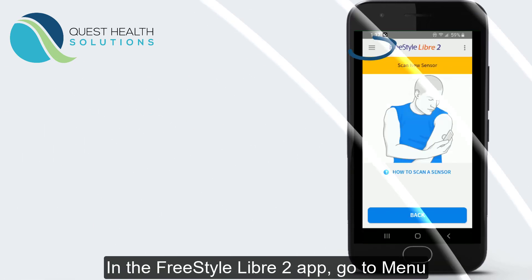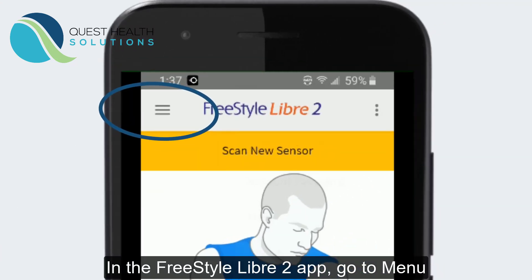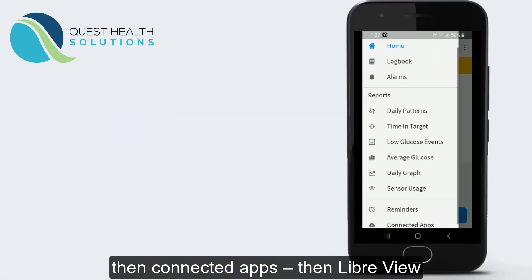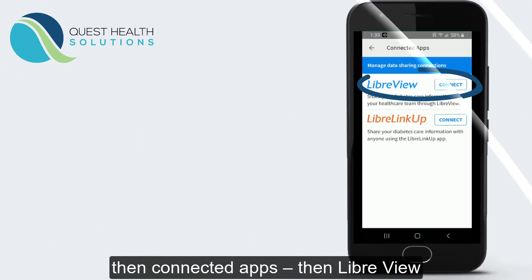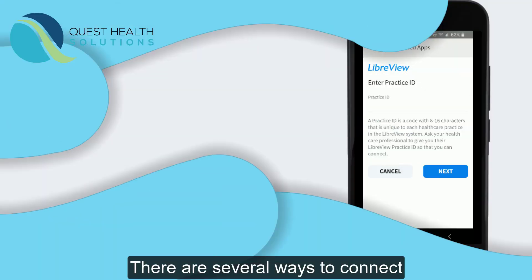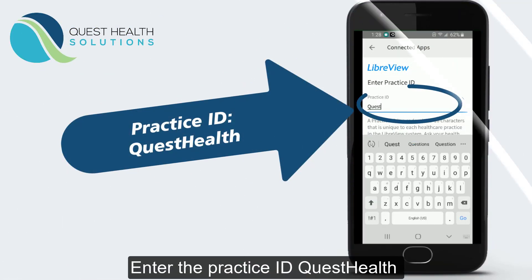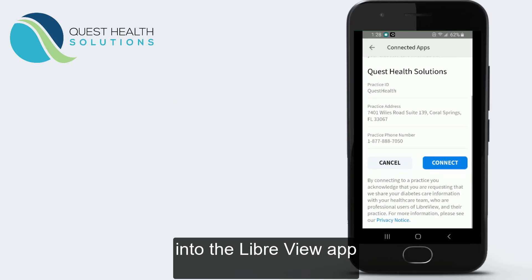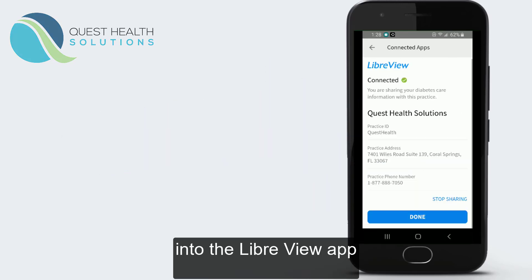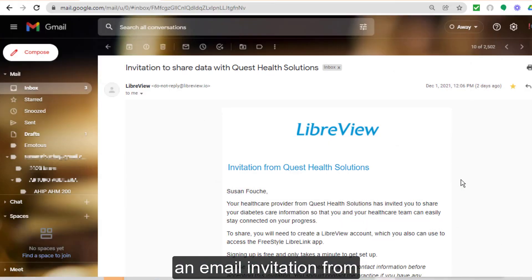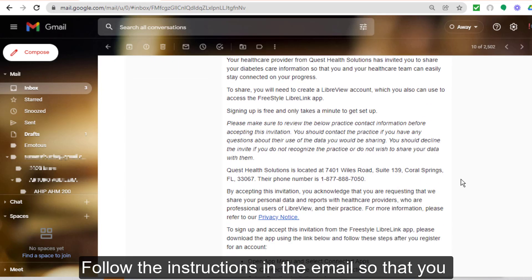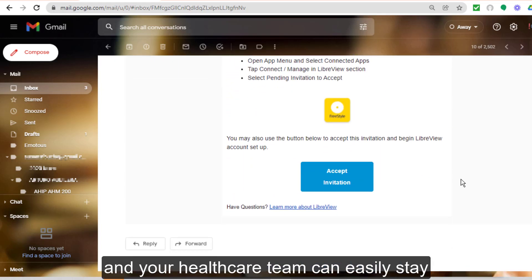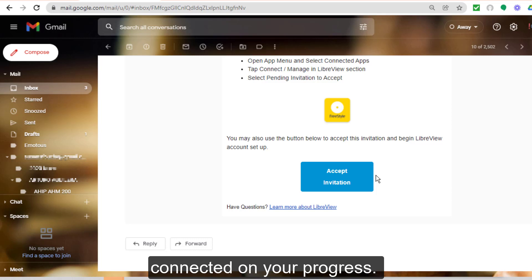In the Freestyle Libre 2 app, go to Menu, then scroll down to Connected Apps, then LibreView. There are several ways to connect. You can enter the practice ID, Quest Health, into the LibreView app. Or simply accept an email invitation from Quest Health Solutions to connect. Then follow the instructions in the email so that you and your healthcare team can easily stay connected on your progress.